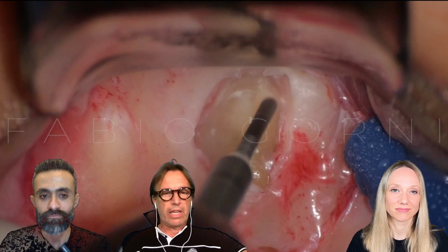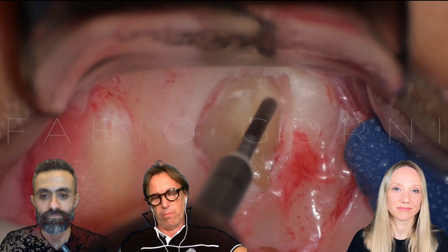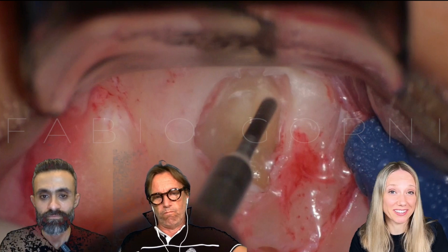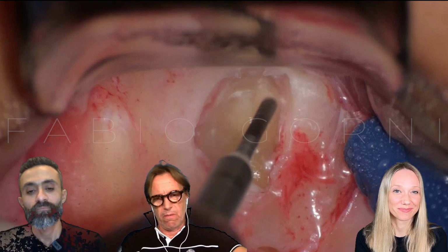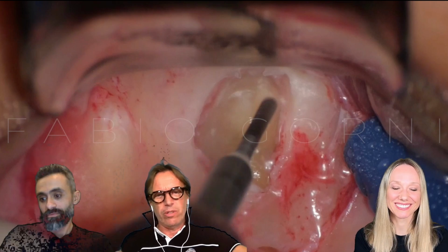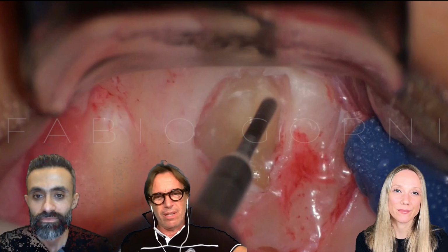So we cannot absolutely predefine the apical resection, in my opinion. It's the same principle as the access cavity in endo. It's exactly the same. Thanks, Francesca. Yeah. So the rationale for treatment is all the time the same. In endo, the rationale for treatment is the same.